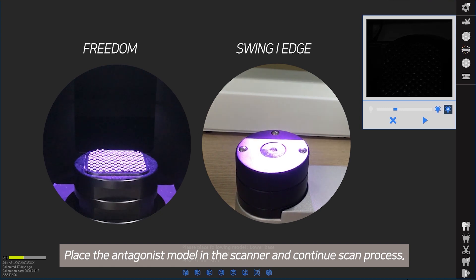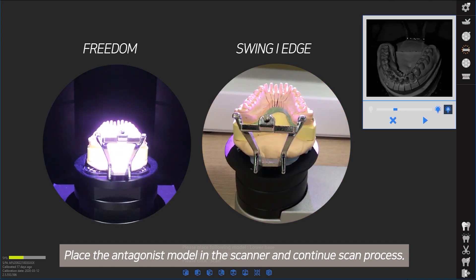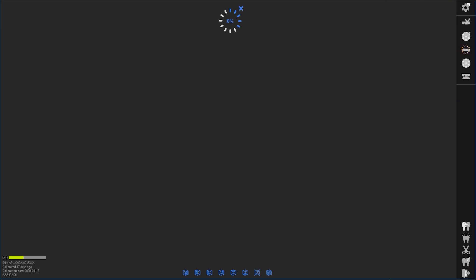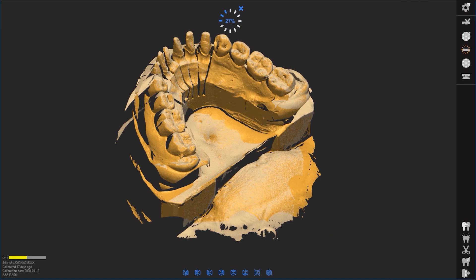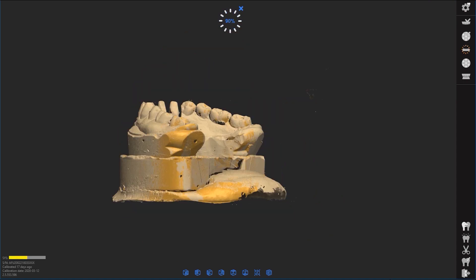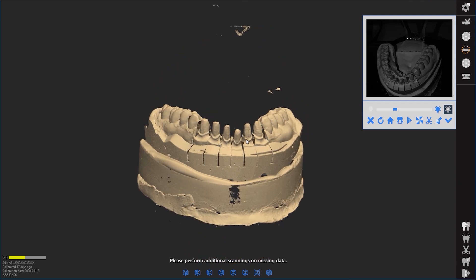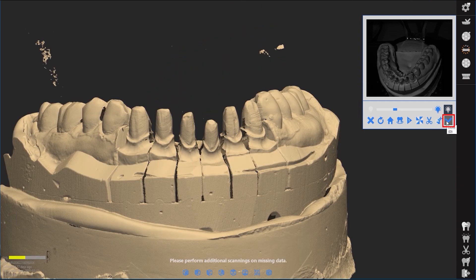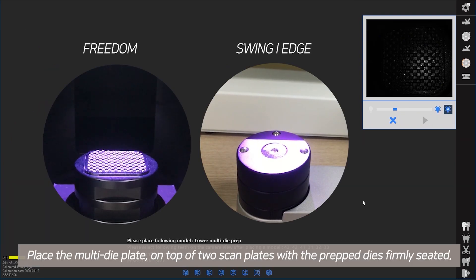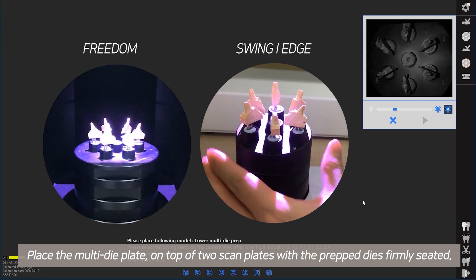Place the antagonist model in the scanner and continue the scan process. Place the multi-die plate on top of the two scan plates with the prepped dies firmly seated.